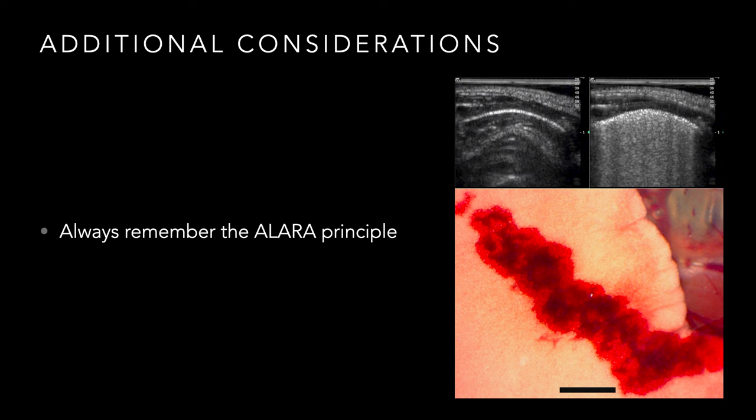And I'd say, again, none of this has been verified in human data, and there's no numbers in human data, but as you're scanning potentially a neonate, just be mindful their lungs are more sensitive than someone who's going to be a 45-year-old adult, right? And so just always keep the ALARA principle in mind as you're scanning. Scan for sure, but do the lowest amount of time, lowest amount of energy that's necessary to accomplish the purpose and the goals for which you're scanning, right?